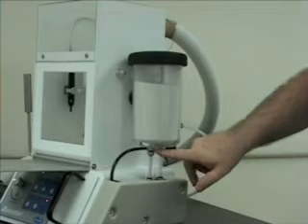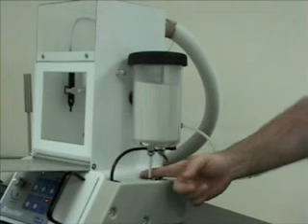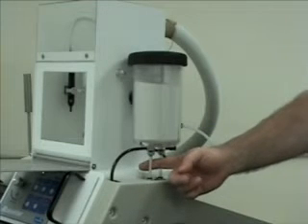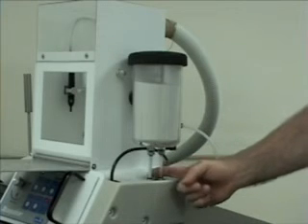The beads exit this aperture here and follow this tube down. This tube should always be full of beads. There should be no air bubbles, and if you put your finger behind it, you shouldn't see a shadow behind it, whereas if I put my finger behind this one, I can see the shadow of my finger behind it.